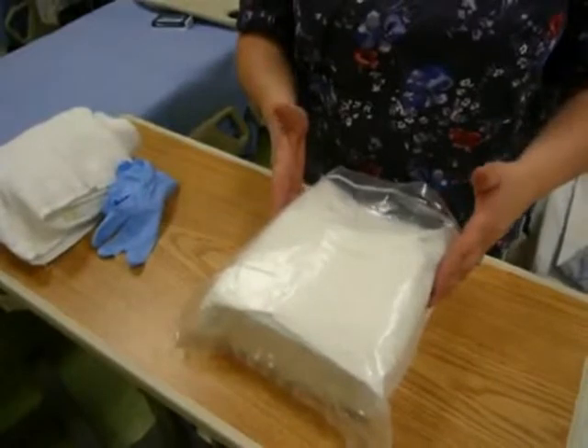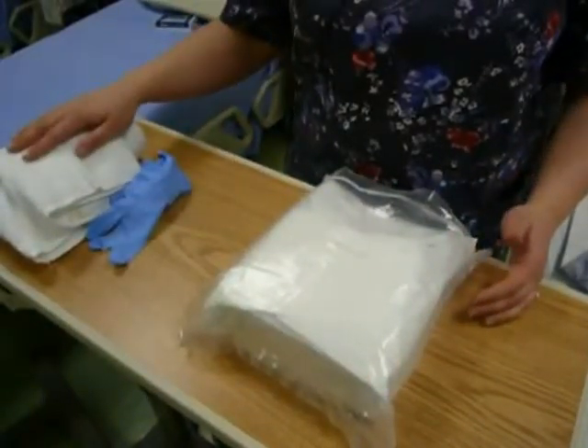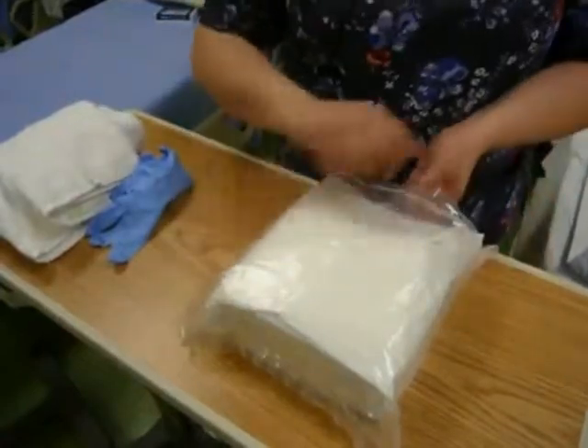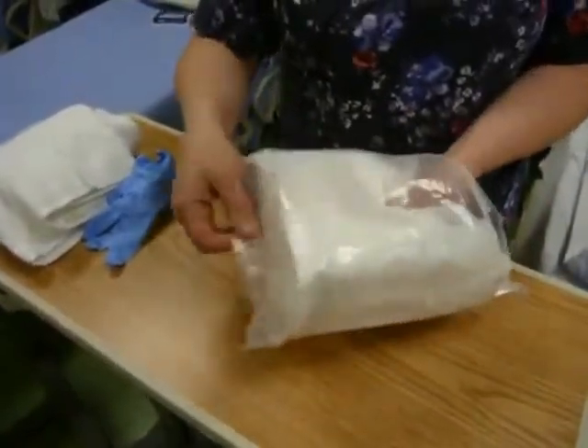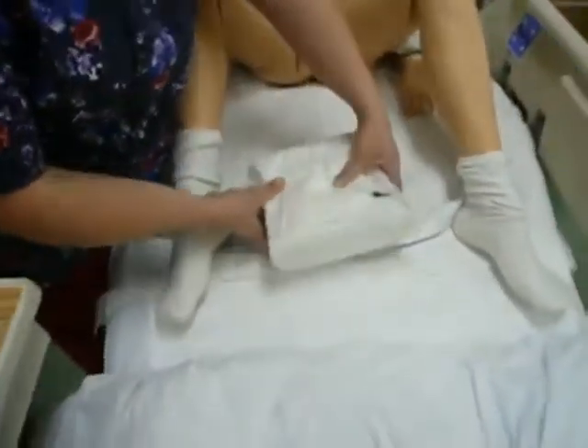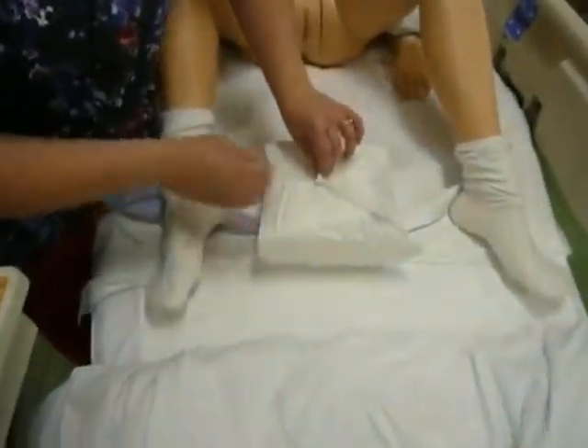What I need is my foley cath insertion kit, a pair of clean gloves, towel and washcloth for when I'm done with the procedure so I can clean up my patient. Now I'm going to open my kit — I need to take it out of the package and I'm going to set this one up in between the patient's legs. If you watch the male catheter insertion, you will see the other way that you can set up your sterile field for foley cath.